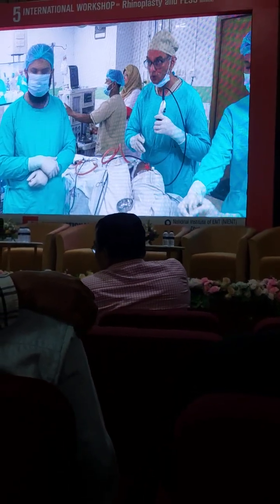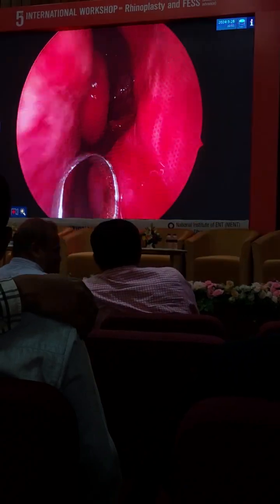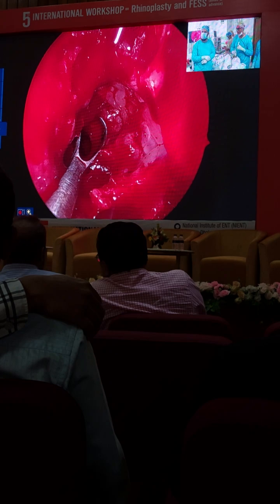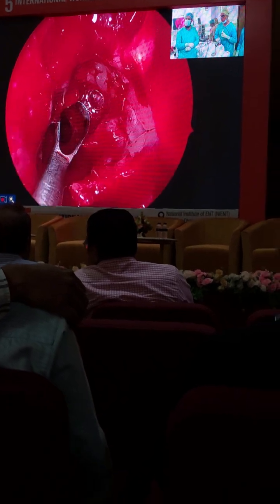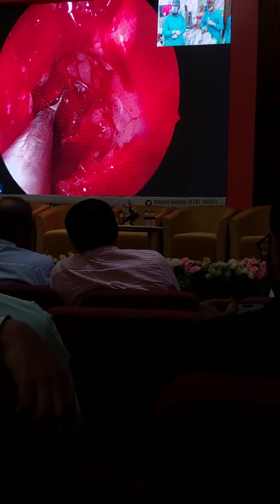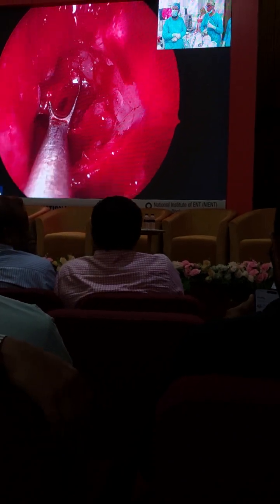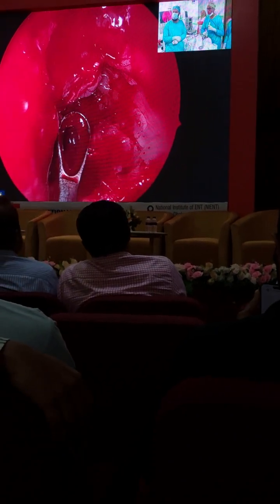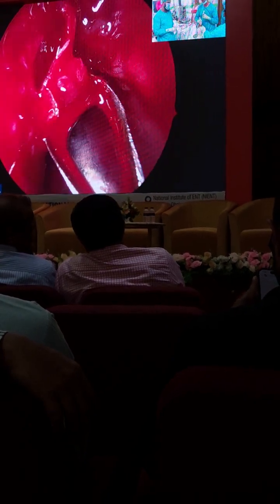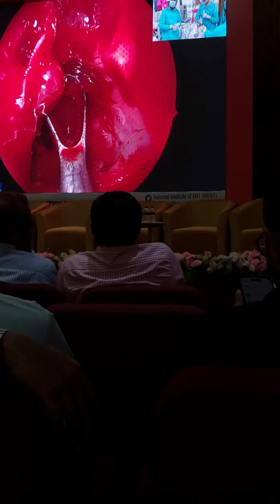So I'm using a wide curette now, okay, ring curette. You don't want a very narrow curette. With this, I can sort of check. I can palpate and check. Is there more bone or not? Can you see my ring curette going in? Yes, yes. And I can just fracture the bone. Not scrape the bone or scrape the mucosa, just fracture. Fracture and remove. And I can see where the skull base is.